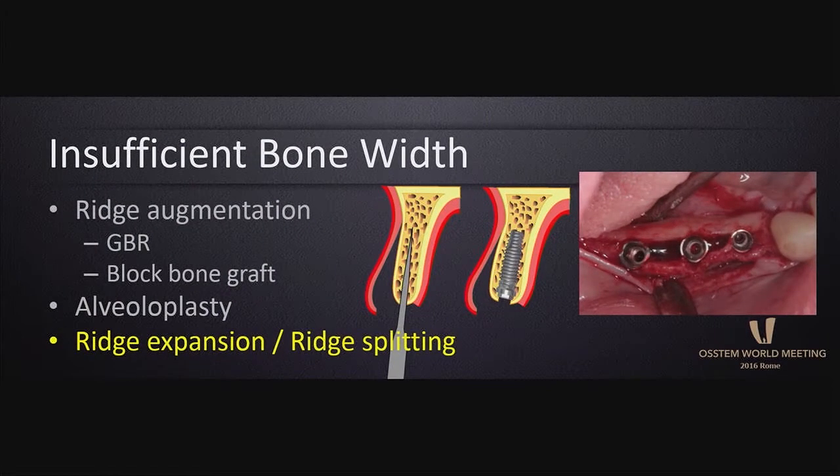Another technique, in case that we do not have enough buccolingual bone, is to do the ridge expansion or ridge splitting. But this is quite a technique sensitive procedure. So high operator skill is required for this technique too.